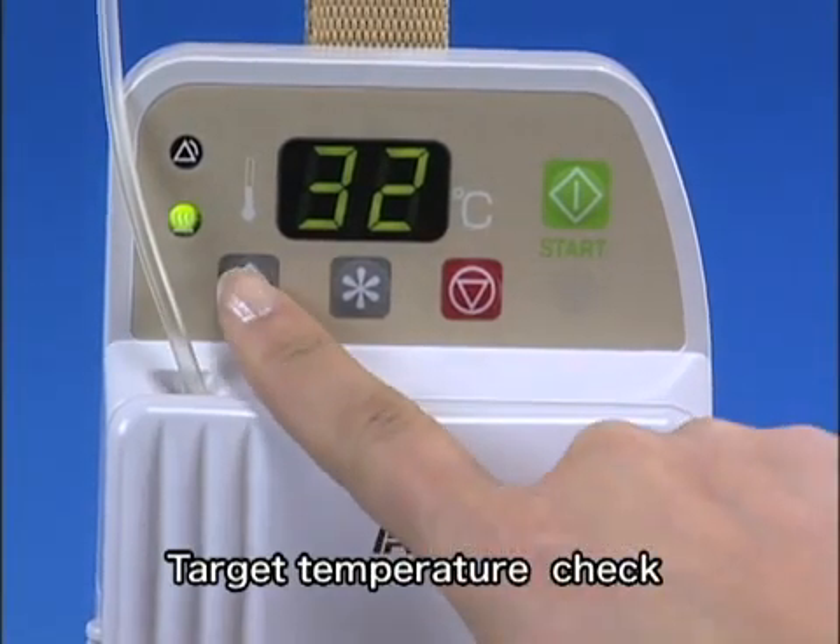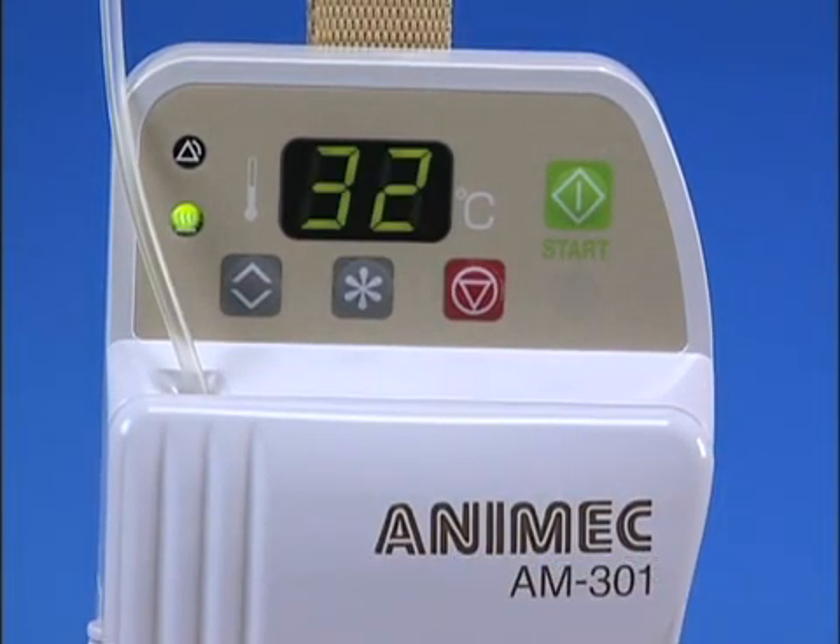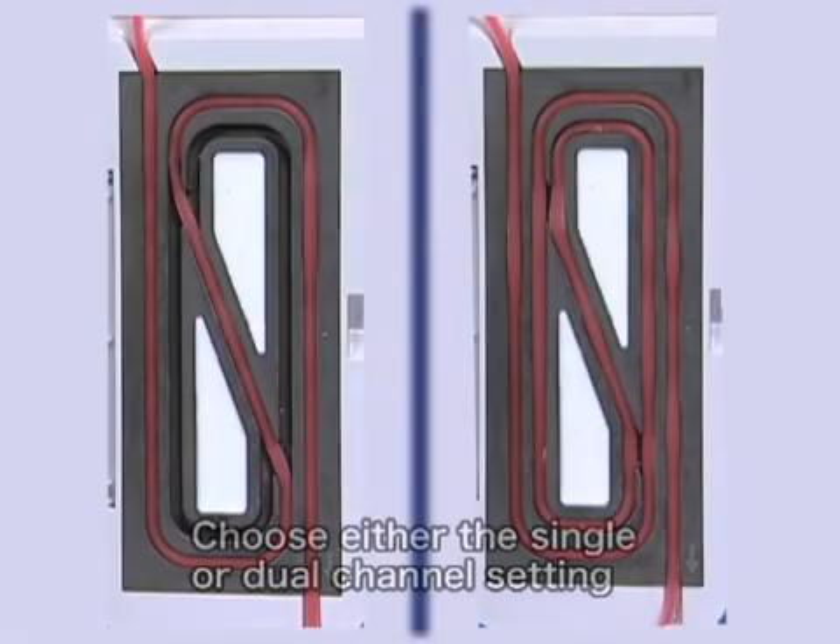The temperature setting can be checked with the temperature setting button while in operation. Choose either the single or dual channel setting.